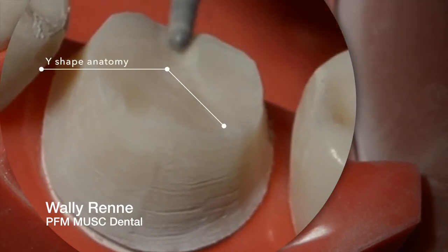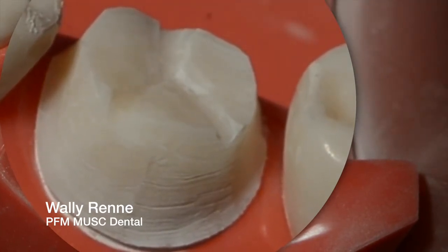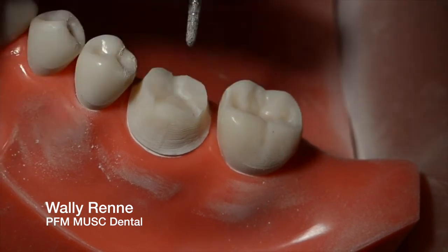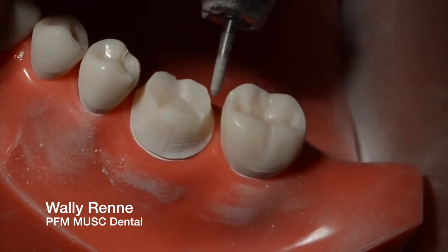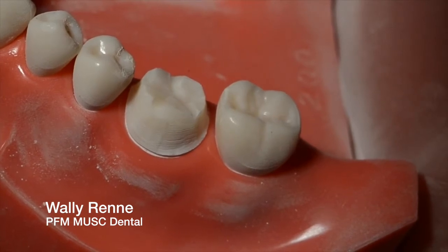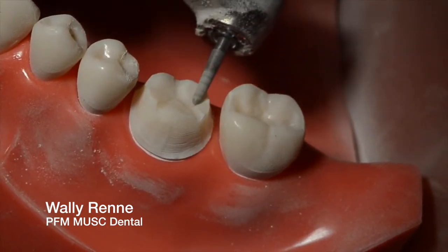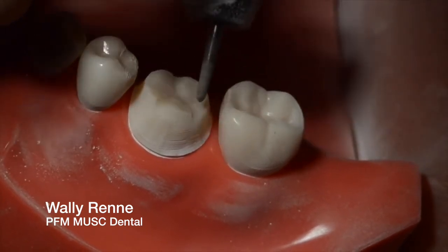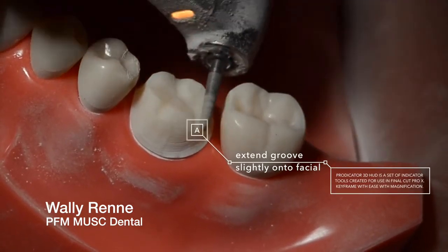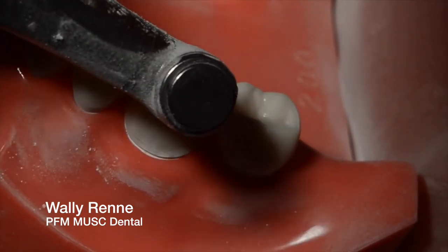Now I'm going to do a Y — lingual groove, two buccal grooves right there, a little Y shape. I'm going to switch to the 018 because I like it a little better for fine-tuning my occlusal anatomy — it's smoother. The bigger the bur, the smoother the cut. Now I'm going to add triangular fossas and transverse ridges very subtly; you don't want to go crazy. You definitely don't want to do all this for an all-ceramic prep — this is mainly a porcelain fused to metal anatomical reduction. Rather than worry about keeping the anatomy from the get-go, I just add it back in later. The lingual should have just a slight bevel; the non-functional cusp bevel is really subtle.